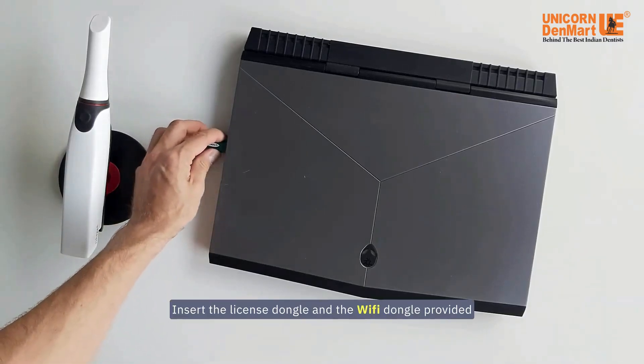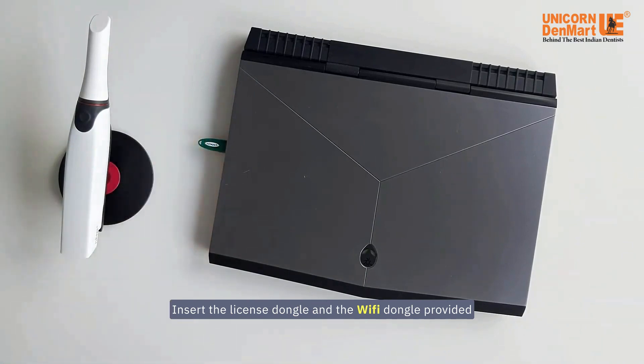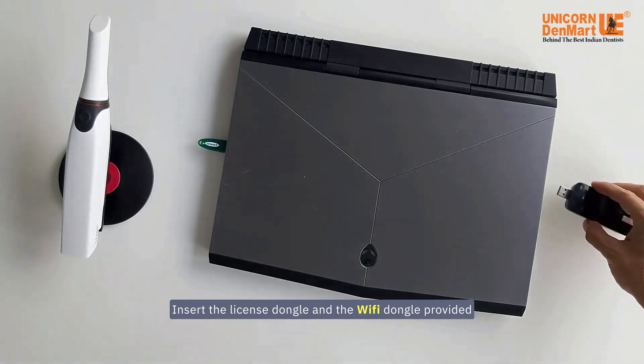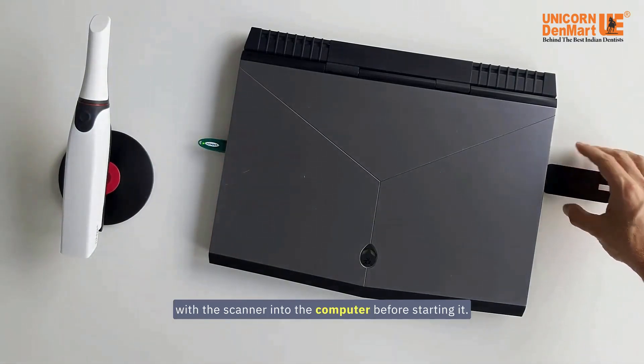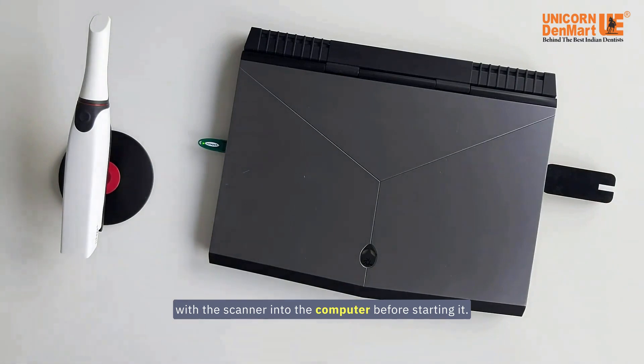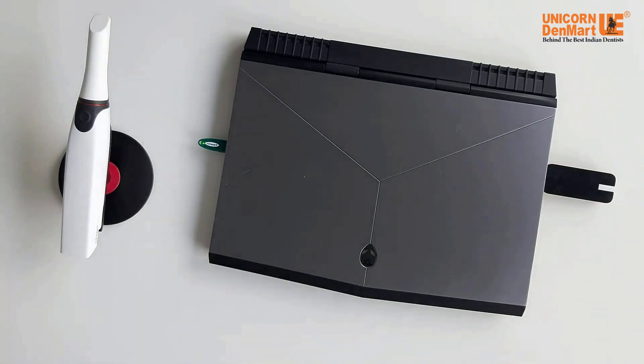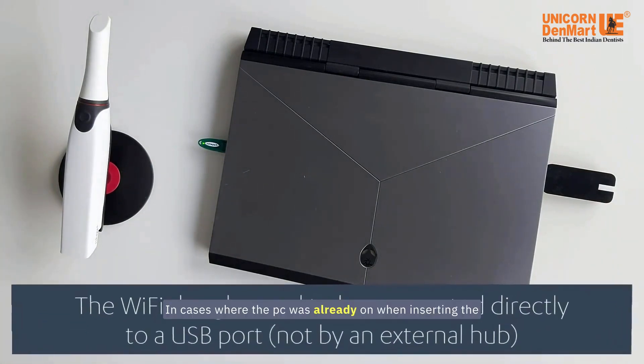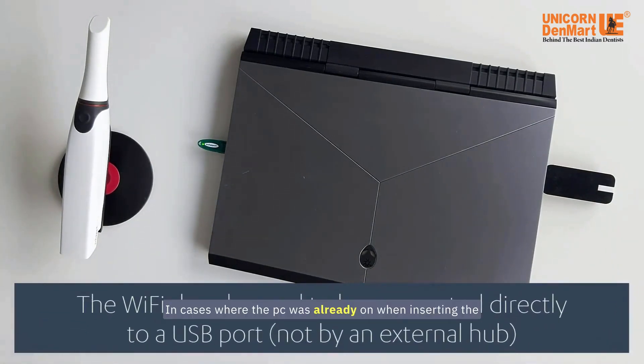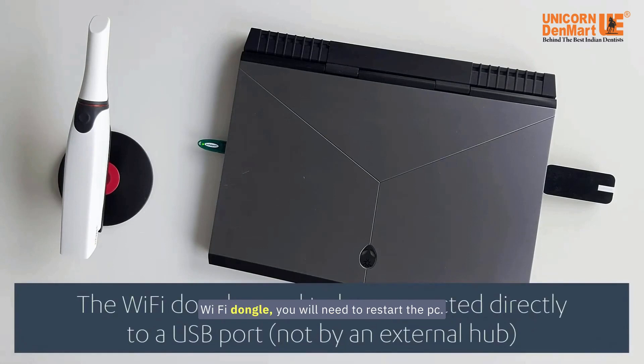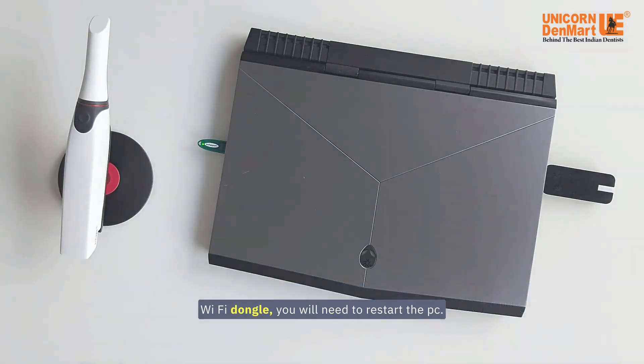Insert the license dongle and the Wi-Fi dongle provided with the scanner into the computer before starting it. In cases where the PC was already on when inserting the Wi-Fi dongle, you will need to restart the PC.